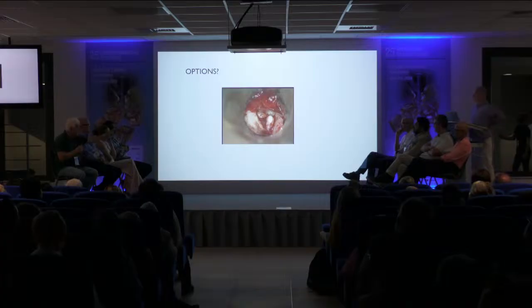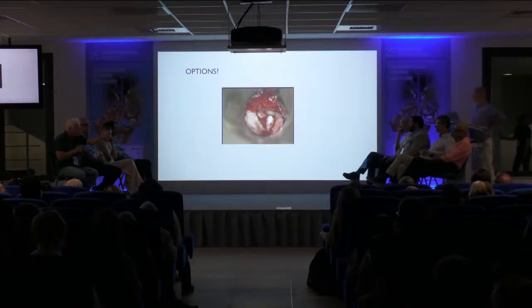You can kind of drill the tip of the incus, or if you are convinced that you're probably going to have a reaction there, the easiest way to do it is to do like Dwayne does. You know, use some cement there. And do you have cement available, ionomer of glass? We do have. Okay. Yeah.